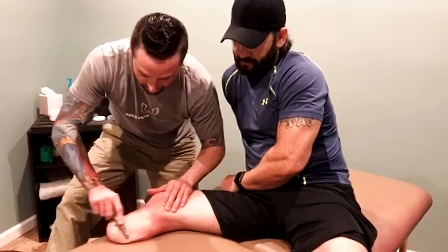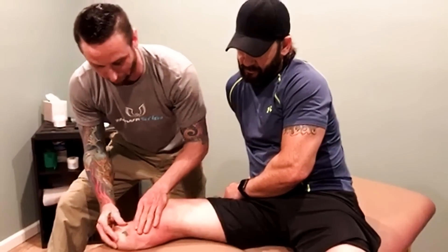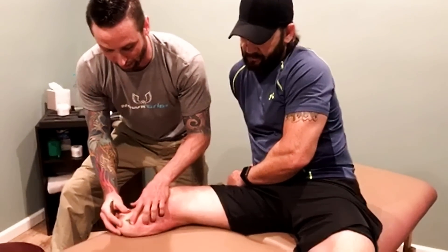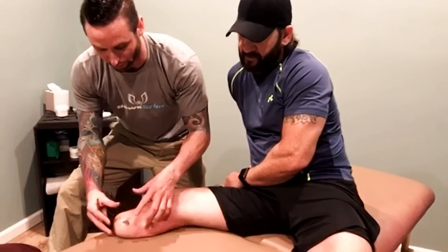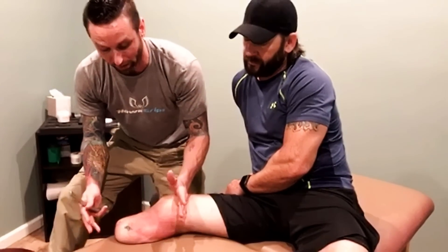And this is so smooth, especially when we get down around where they had to tie this up. This was actually like a crevice that looked much tighter in the beginning, and now it's opened up. As far as the socket not fitting tight in the limb anymore, he's not dealing with nearly as much of that, and the spasms are almost totally gone.